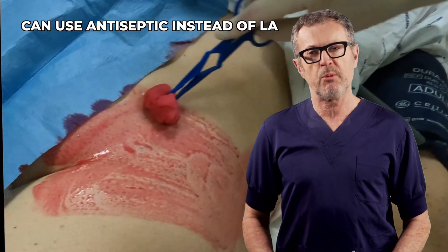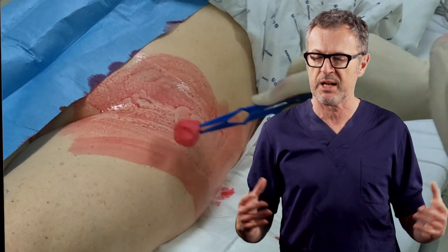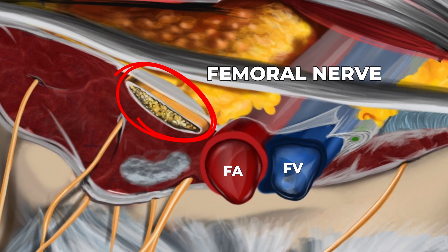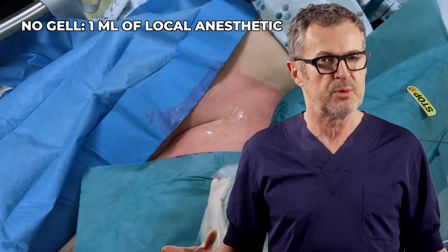Let's now see the second pain block. Some folks may use the prep solution; however, this may not always be best, as some prep solutions may contain alcohol, which is neurolytic. While the risk of introducing alcohol from the prep solution to the major peripheral nerves is theoretical, we still prefer to use one or two milliliters of local anesthetic during flushing of the needle.